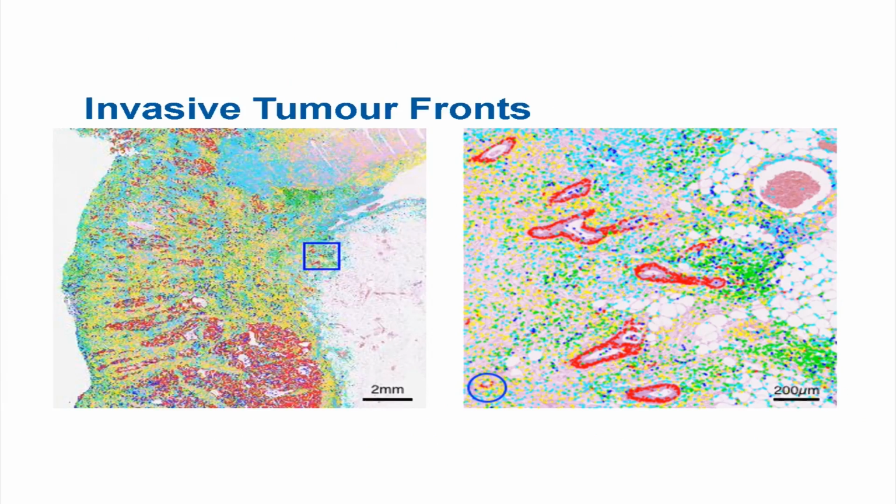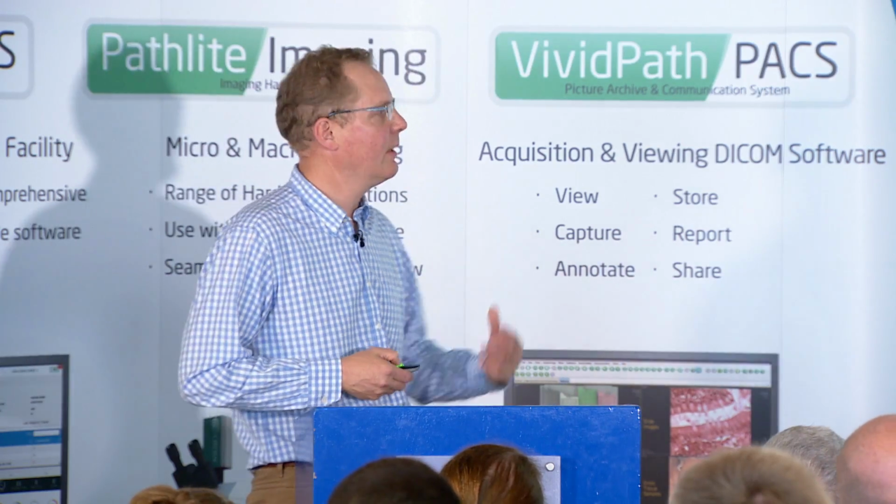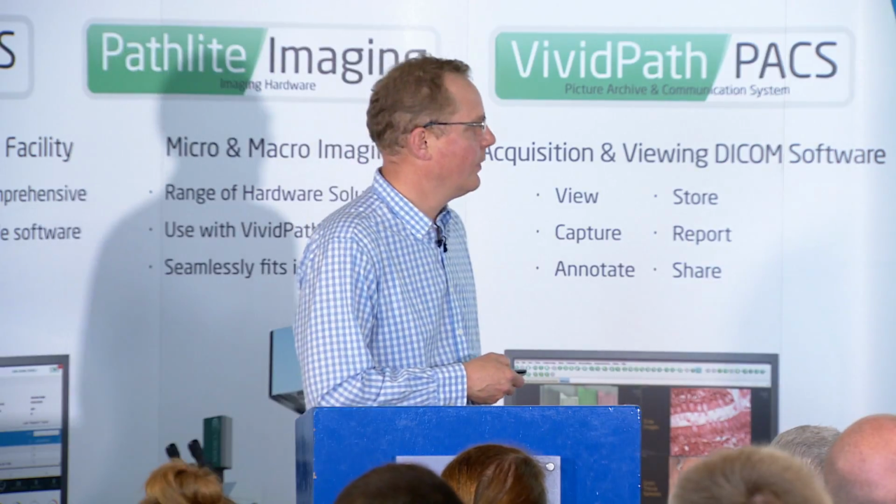But as pathologists, we recognise that we can see some tumours such as this one here, where there's clearly invasion of the tumour into the adipose tissue in a very spiky and aggressive way, and we would call it an infiltrative margin. Whereas tumours which do this, they have a big lump of tumour and they gradually push through. We would call them a pushing margin. And by and large, there is some association between the two. Infiltrating tumours do tend to do worse than pushing tumours.